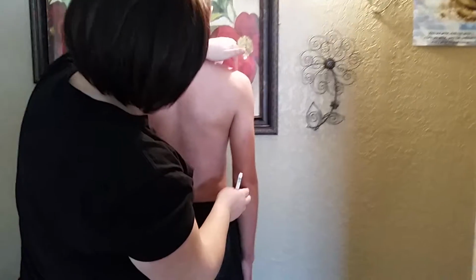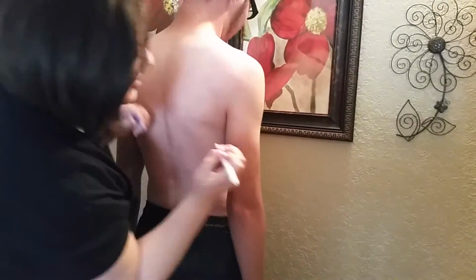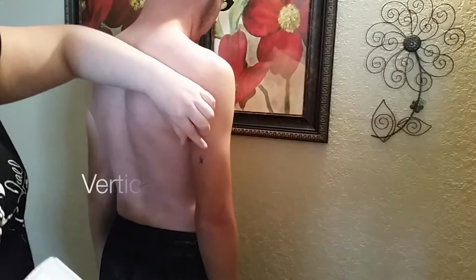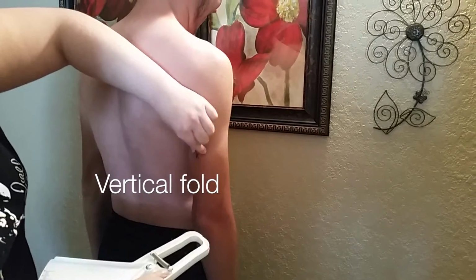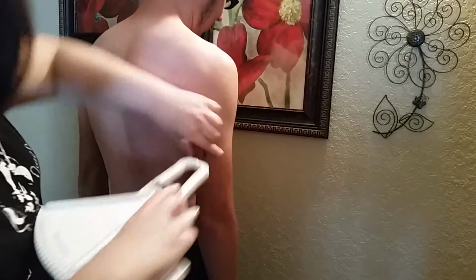For the triceps, measure halfway between the acromion and olecranon processes and the posterior midline of the upper arm. Obtain a vertical fold. Hold for 1 to 2 seconds and release.